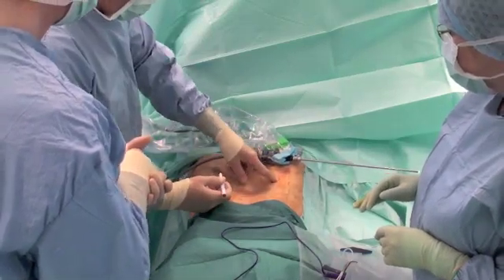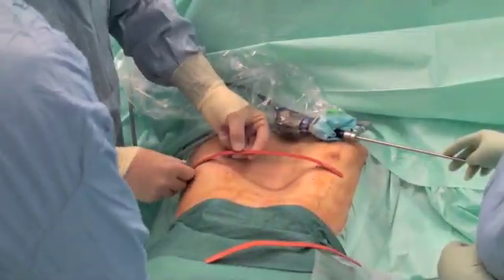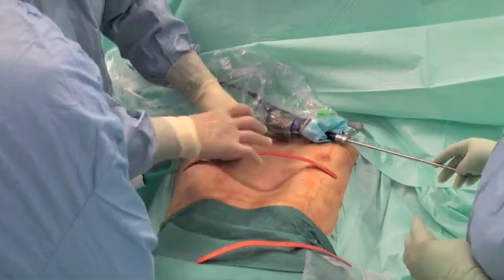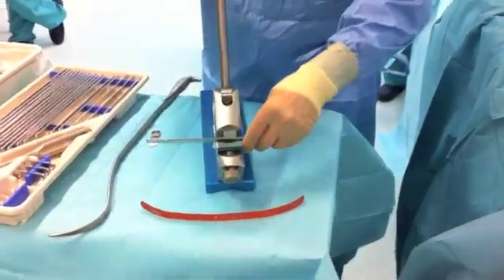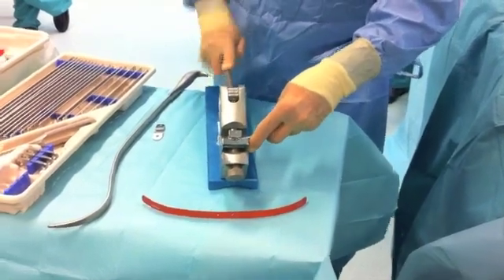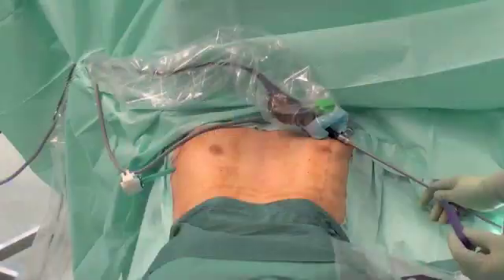Professor Peeligard is marking the intercostal spaces where we intend to place the bars. This is a sizing device — this isn't the actual insert device. We can bend this very easily with our hands just to get the right bend. Professor Peeligard pioneered the short bar technique where we use very short bars; I think this is an 11-inch bar. It is bent into its initial shape using the on-table bending device.